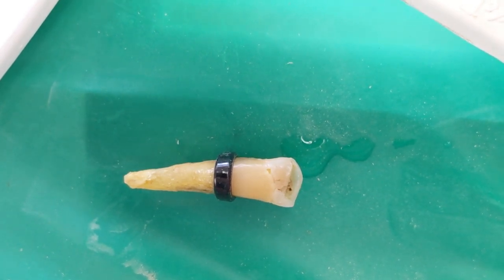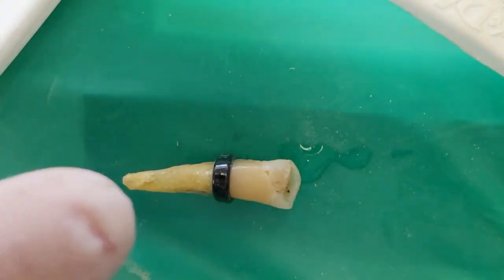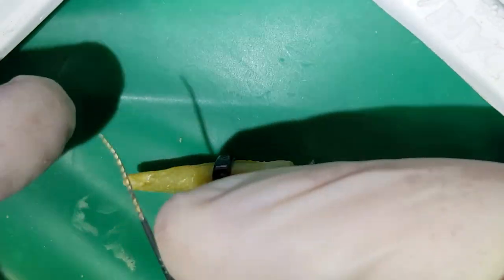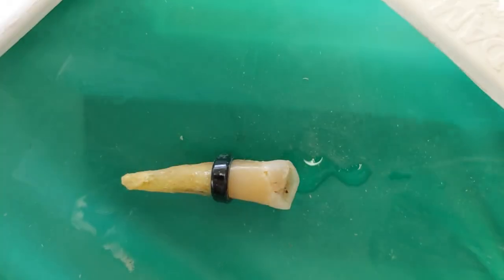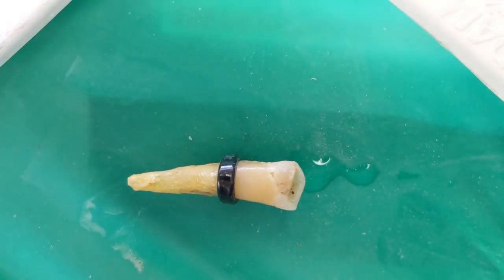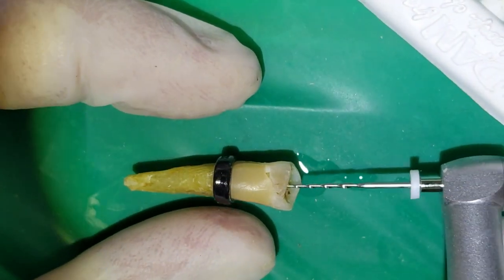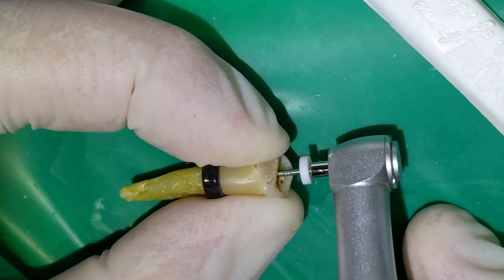So the next size after 30 is number 35. This is a different brand file. This one's much stiffer than the last one was. You can see the difference. These are nickel titanium, and they'll actually bend. This one's a little bit stiffer. So this one I'm going to do with a little bit different action too. Instead of it rotating, just spinning, I'm going to use this because it is stiffer, and it's reciprocating. It's just going to twist back and forth. Can you see that? Just zipping back and forth. But we use it the same way, basically, just to clean. Scrape it along the sides of the teeth. And again, you just want to work it up and down.